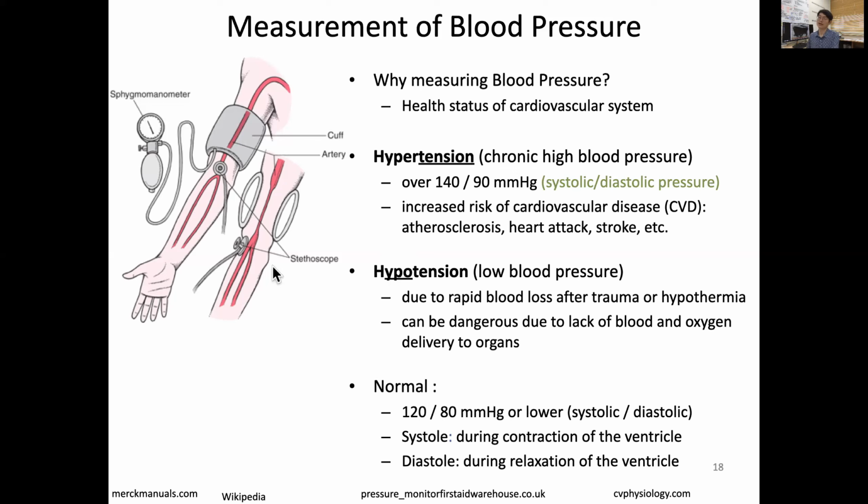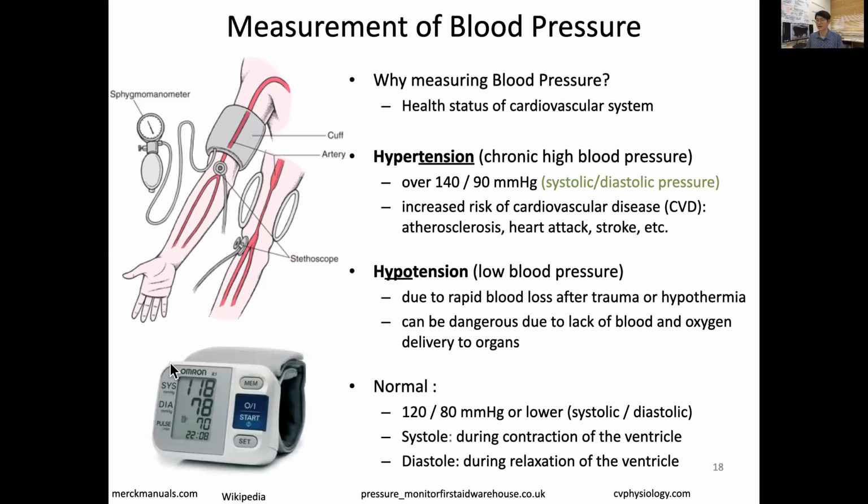Nowadays, these traditional measurements can be replaced by more advanced technology, using, remember, a mechanical sensor, measuring the pressure by the stretch of the surface of this cuff. That is the electronic way, with a mechanical strain gauge inside which measures the pressure directly. And if you analyze this data well enough, you can even measure the pulse rate as well.